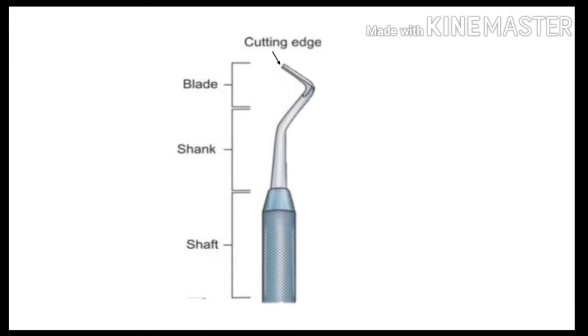You can see in the figure, this portion is shaft, this portion is shank, this portion is blade, and this upper portion is cutting edge.